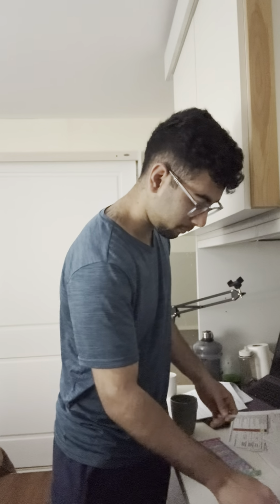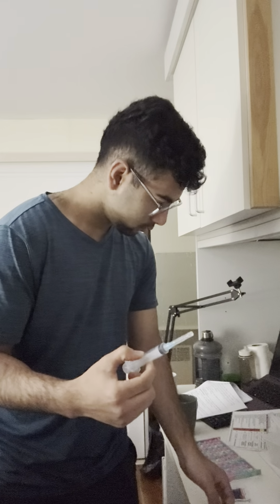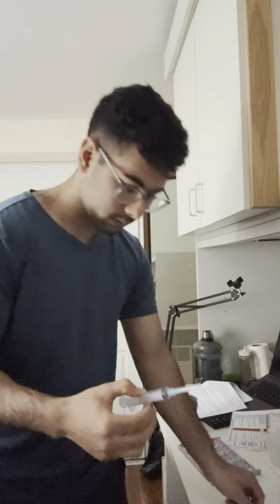Now this is the first flush that we're gonna do. This is a pre flush. I'm gonna make the post flush as well. So this is gonna be the post flush. I don't know the saline, this is different.